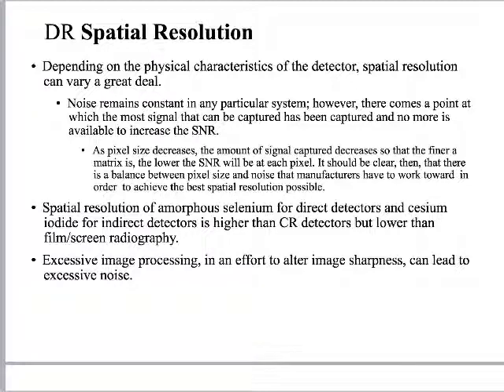Well, the very first thing I would encourage you to look at is its spatial resolution, right? It's a big determiner, and there's a lot of variance. Even within the same manufacturer, even if I'm just talking about GE, it matters which GE model I buy. And the number one thing, the thing that's going to be kind of the fuel efficiency question, or however it is you purchase a car, like what am I interested in? It's fuel efficiency or it's horsepower or whatever, is spatial resolution, right? The reason you have the different price tag is because of this.